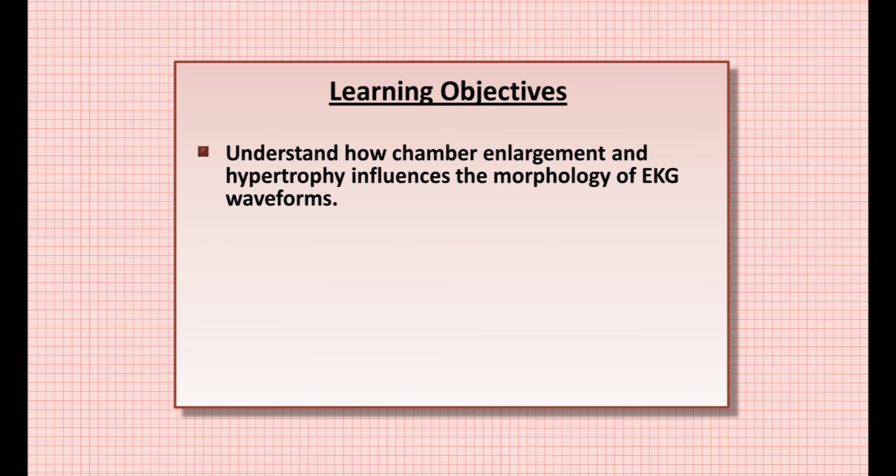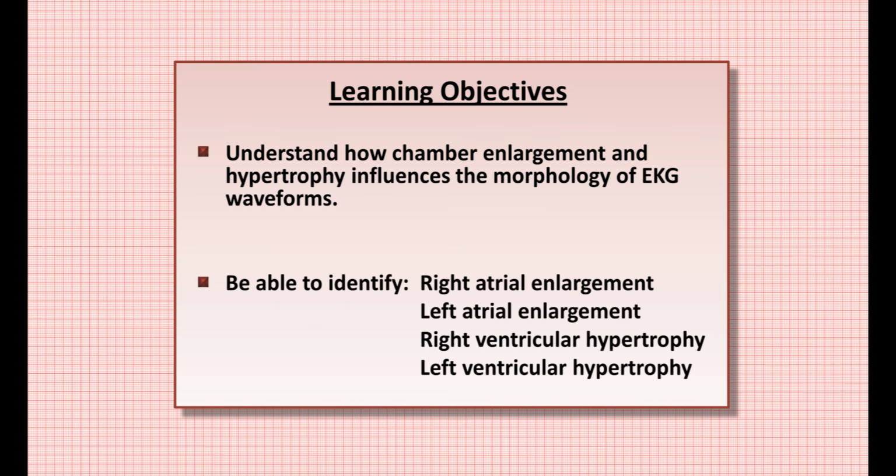Here are the learning objectives of this lecture. First, to understand how chamber enlargement and hypertrophy influences the morphology of EKG waveforms. And second, to be able to identify right and left atrial enlargement and right and left ventricular hypertrophy.